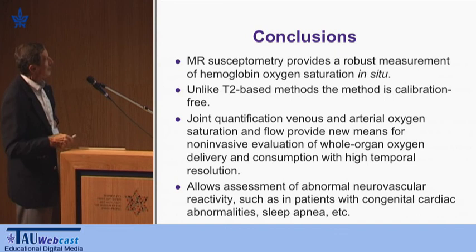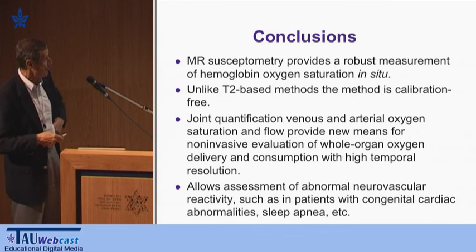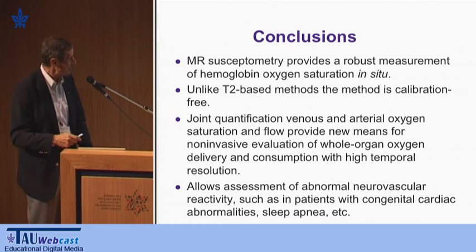So joint quantification of venous and arterial oxygen saturation together with flow, which I've shown you, provides a means for non-invasive evaluation of whole organ oxygen delivery and consumption with quite good temporal resolution. As I said, we are in the process of improving the temporal resolution further.